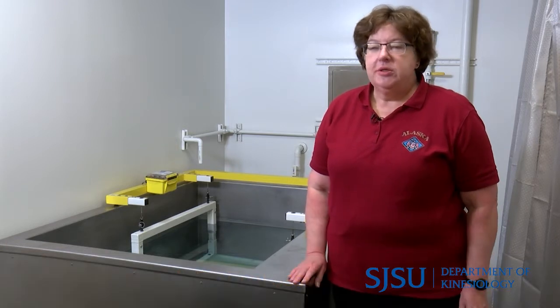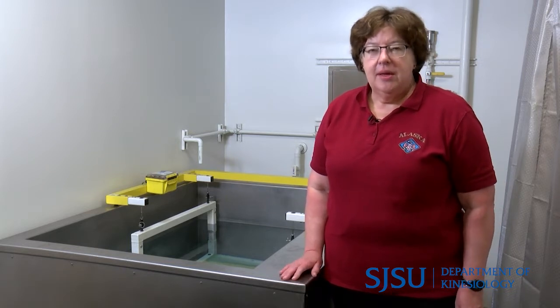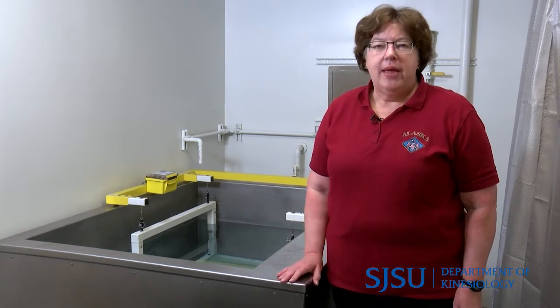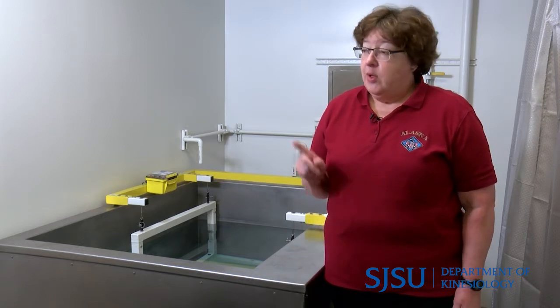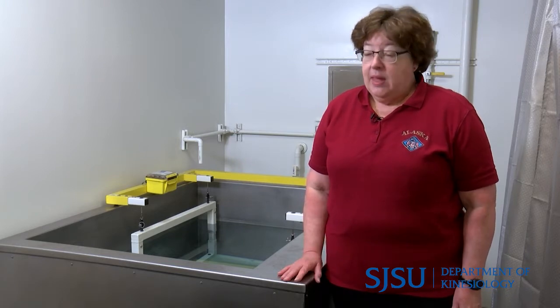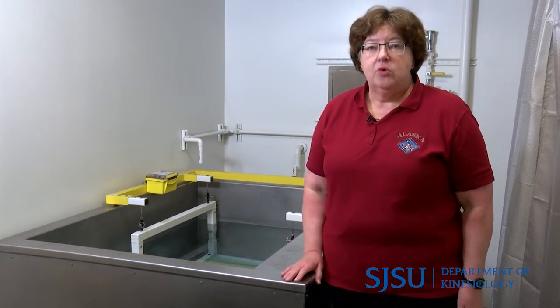Today we're demonstrating underwater weighing or hydro densitometry. Professor Alev is our subject and Professor Costa is the test administrator. When we look at density of the body by underwater weighing, we're looking at mass divided by volume. Mass is measured on a regular scale, and volume is determined by the displacement of water, or the loss of weight underwater.